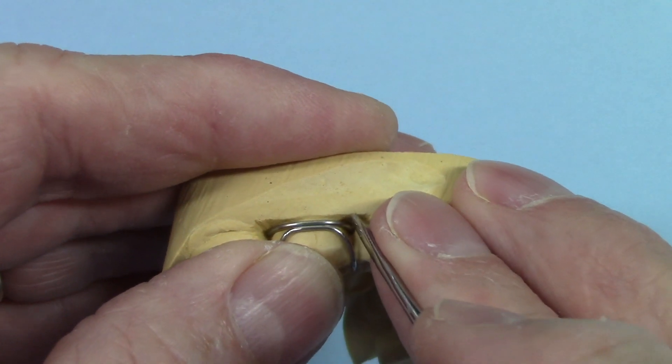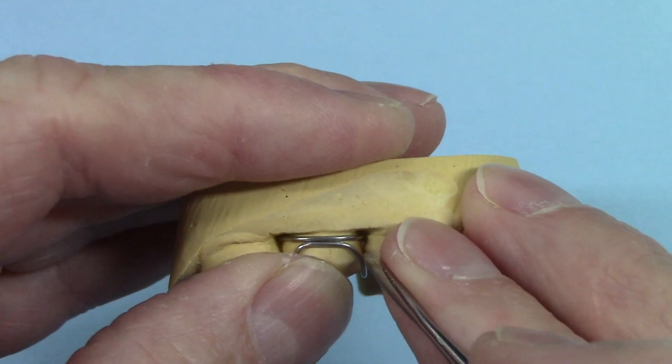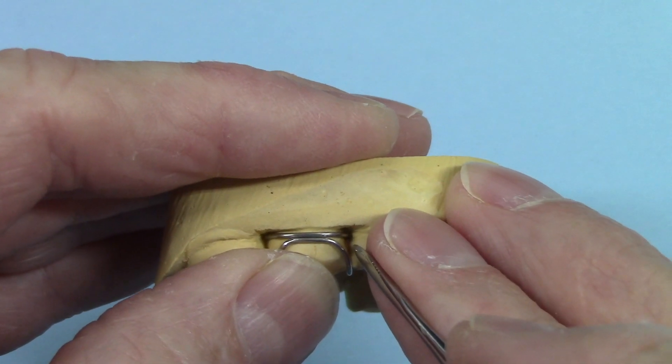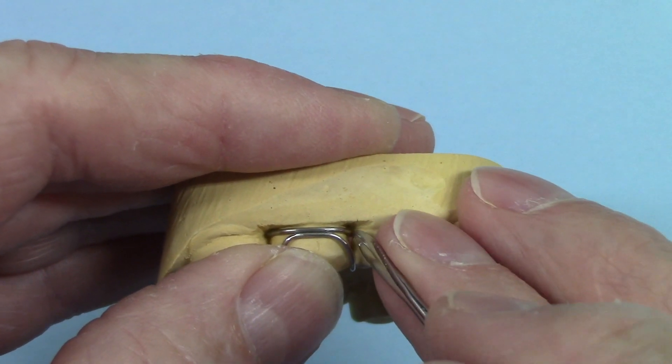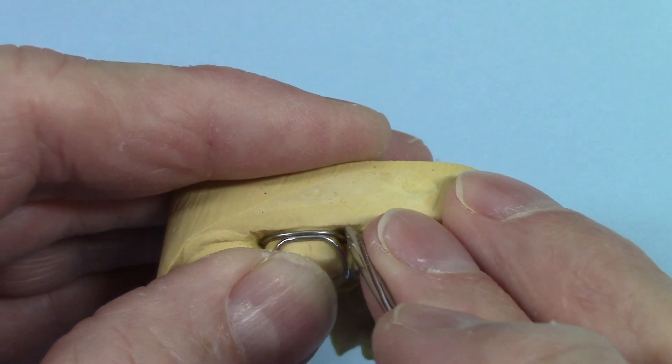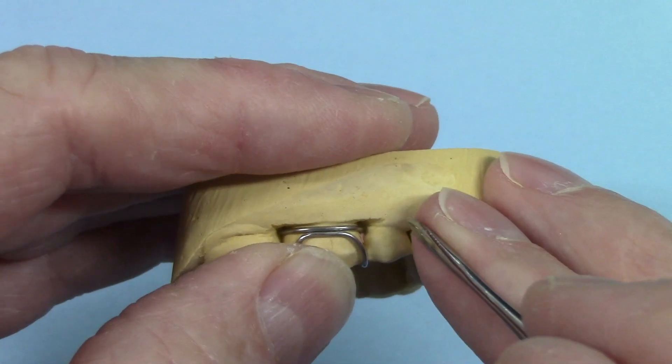Then cover that up with a heat protective compound and bring it right up to here. If you just leave the stone there, it could heat up and boil the water inside the stone if there's any left in it, and it would cause it to pop and you could have problems. So if you cover it up with a heat protective compound, it alleviates that problem.